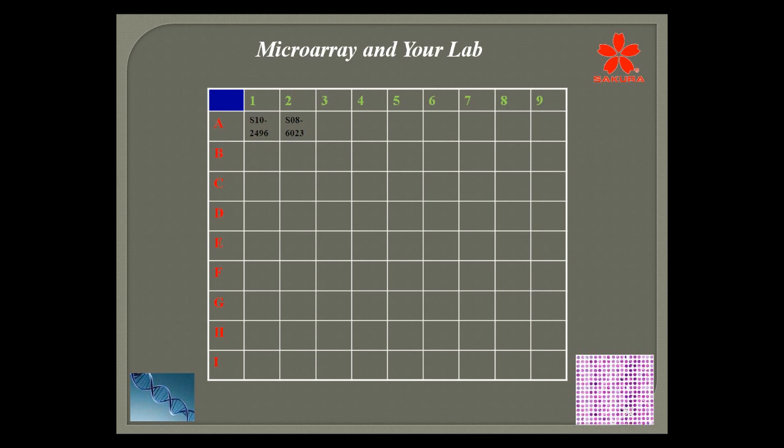The next slide is showing you now where you have actually recorded a case number in A1, which is S102496. Then when you make the next one, you'll get A2, right? And you'll just keep this process going until it's complete.